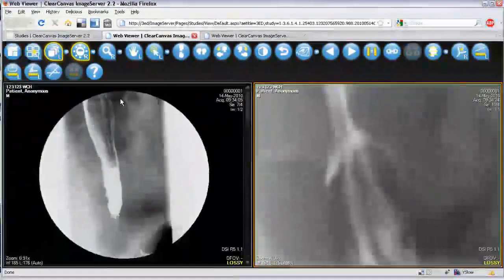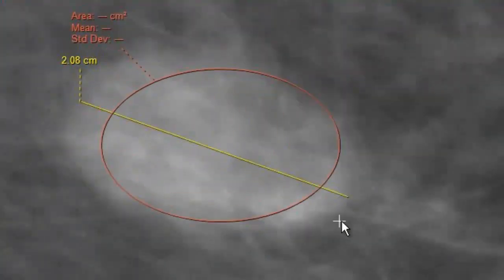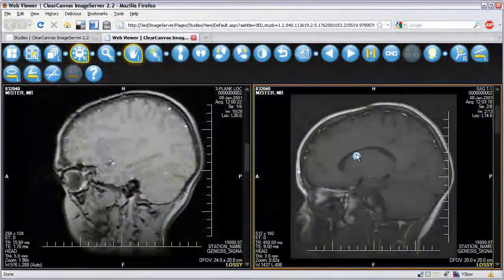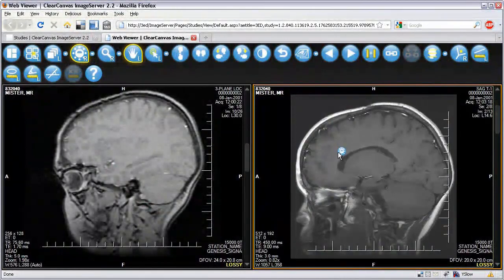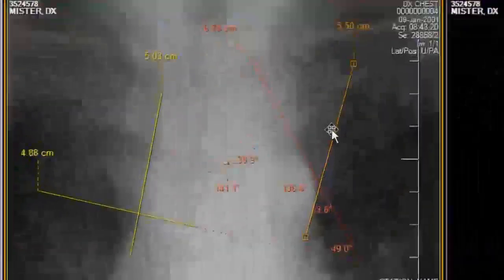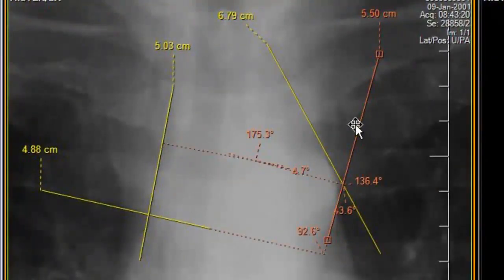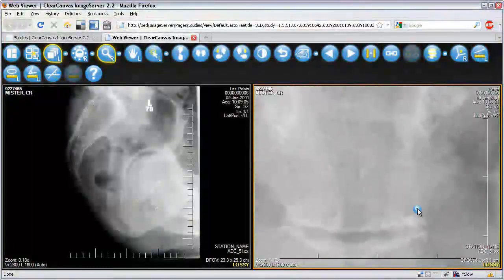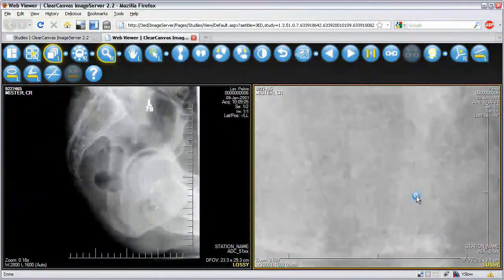The ClearCanvas webstation is a web-based image viewer built on the architecture of the ClearCanvas workstation desktop application. Technically, all of the features available for the desktop application can be made available for the webstation with a minimal amount of coding.